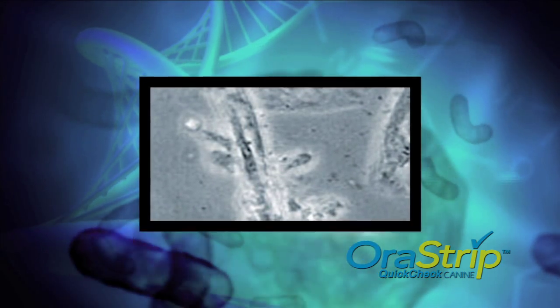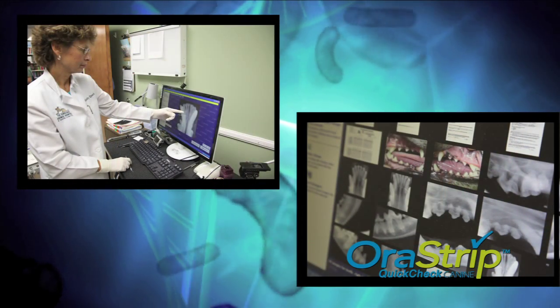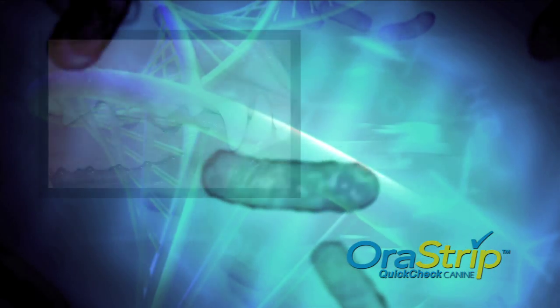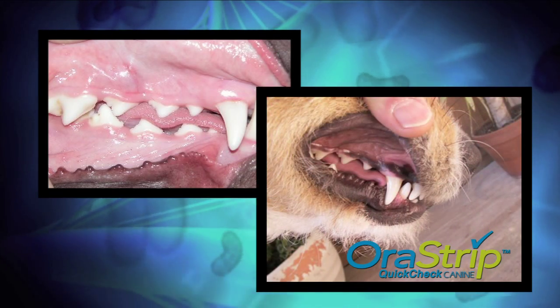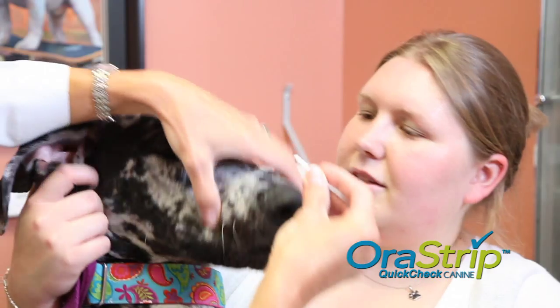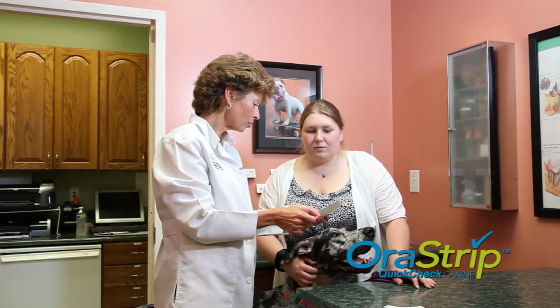In clinical studies, high strip values indicating an active periodontal infection were associated with radiographic evidence of progressive bone loss, which occurred in the absence of clinical manifestations during routine visual examinations. Additionally, disease was underestimated by clinical observers in dogs presenting with varying degrees of visual inflammation and gingival recession, further evidenced by progressive bone loss and disease activity detected by use of the strip. OraStrip test results increase client awareness and prevention of periodontal disease by increasing compliance for veterinarian recommendations for professional cleanings and home care.